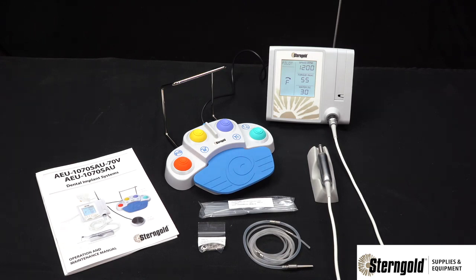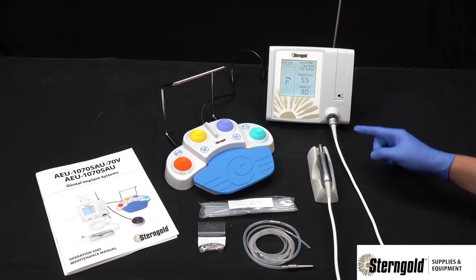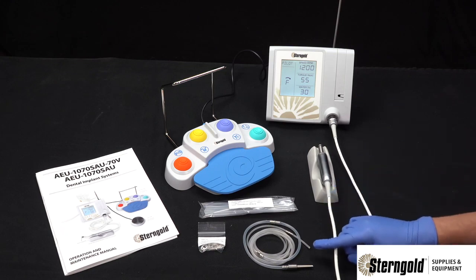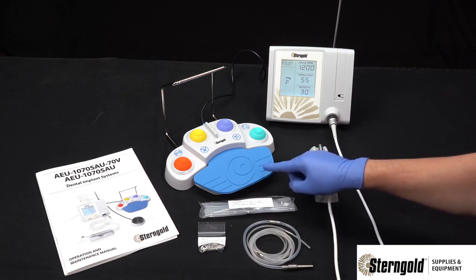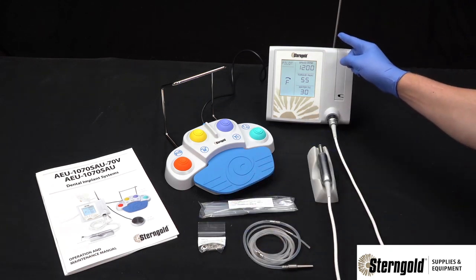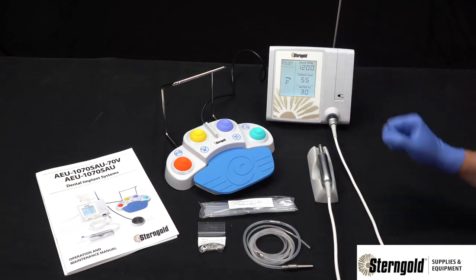Package contents include the console, hand motor, motor holder, tubing set, multifunction foot control, product manual, irrigation bag hanger, and the power cord.